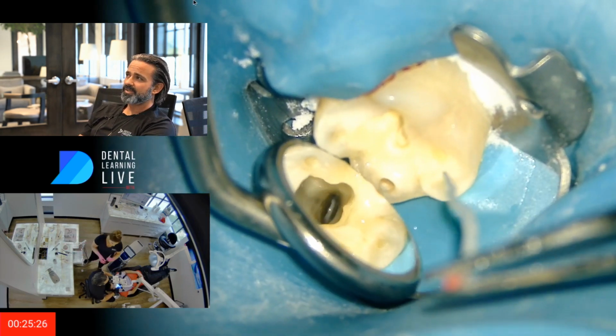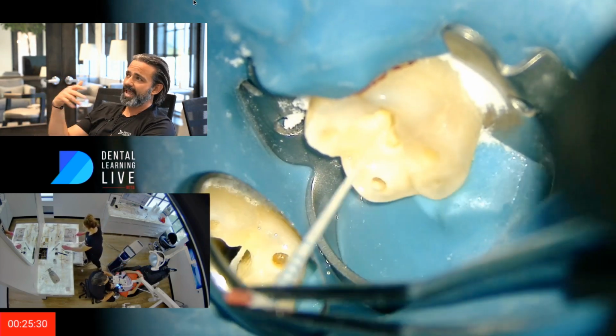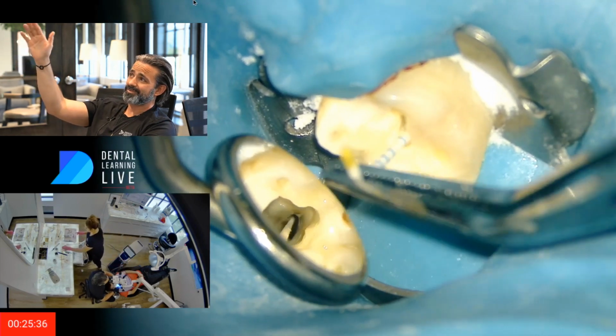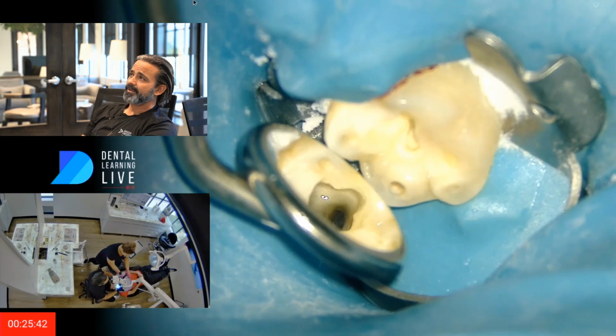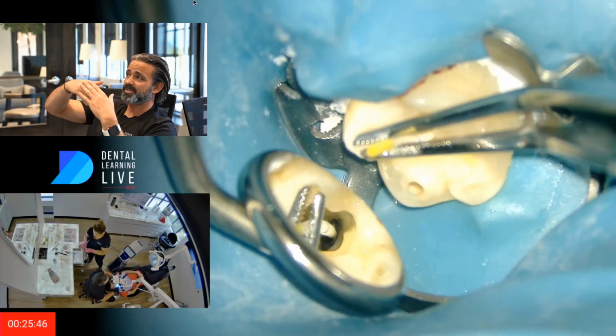So you can still see at the very end I have this habit where I'll still rinse with hypochlorite, and I'm just trying to get the right size paper point with 30, 25, now I'm down to a 20, and I'm going to wick out the juice in there, and you're going to see that thing, how clean that is and how that isthmus completely opened up.